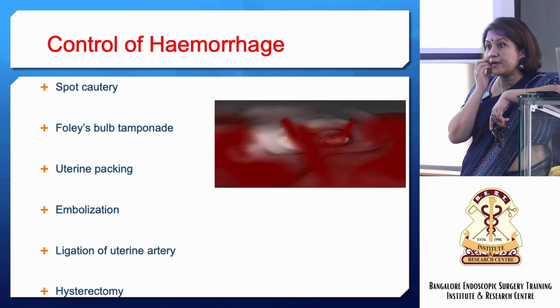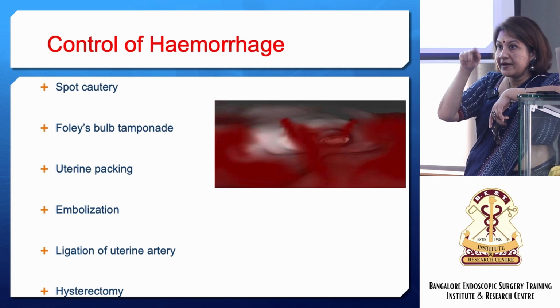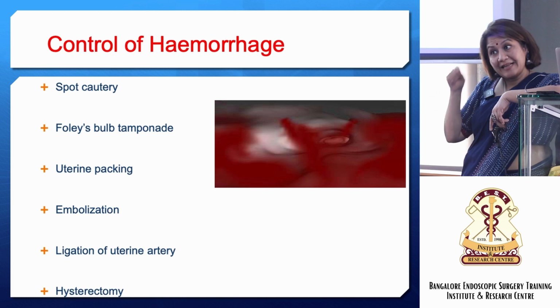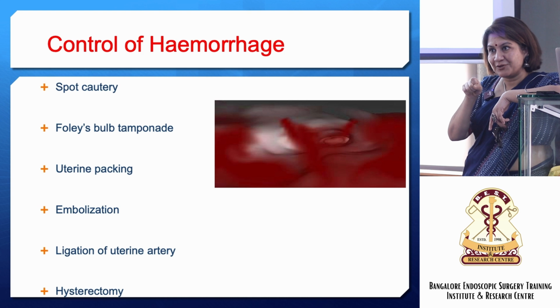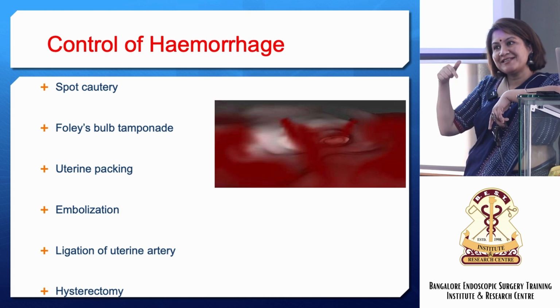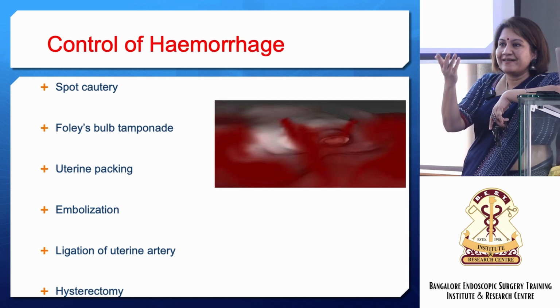Hysteroscope, wasted a lot of time doing hysteroscope, couldn't do anything. Then we put in a laparoscope. We thought we will make an incision on the fundus of the uterus, and we tried putting in laparoscopically some dilator kind of a thing into the internal os, because that was stenosed. Her whole lower segment was completely adherent. So we made an incision, put in the dilator, and it came into the bladder.